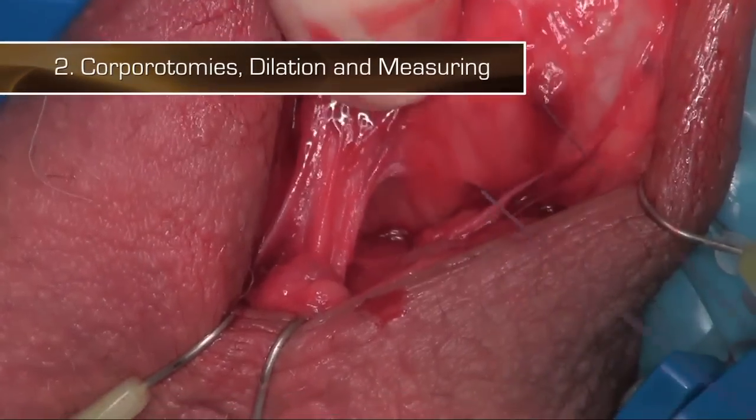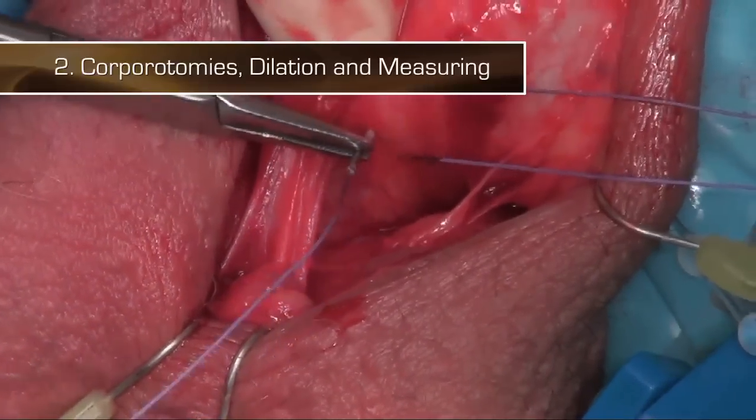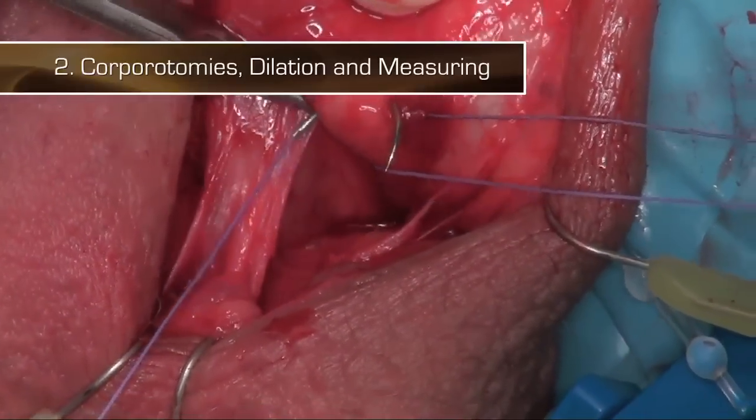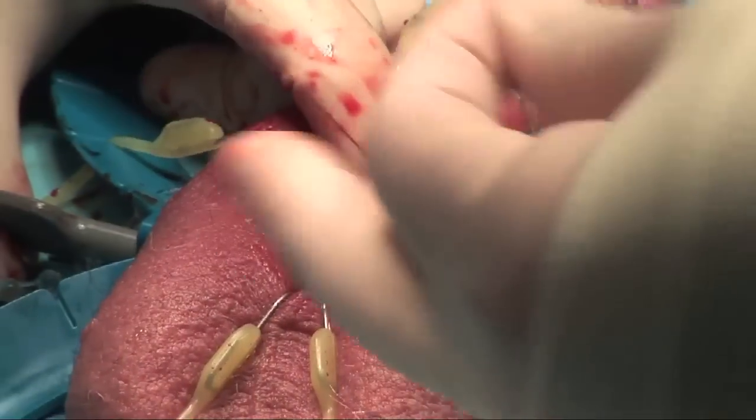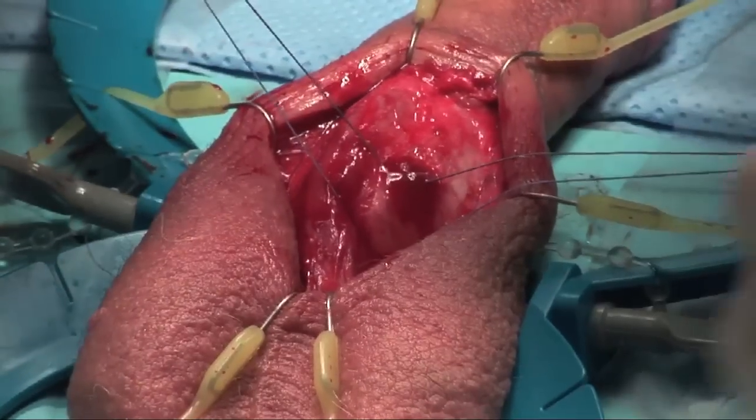I'm doing pre-placed sutures, 2 Vicryl. I like placing pre-placed sutures because it's safe and doesn't hit the cylinders. So I place two of them, traveling about a centimeter and a half a piece, equal, away from the urethra.